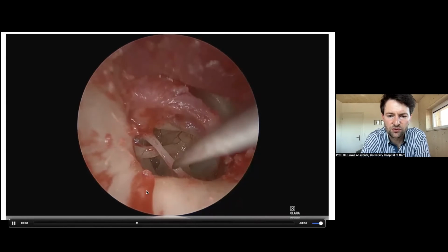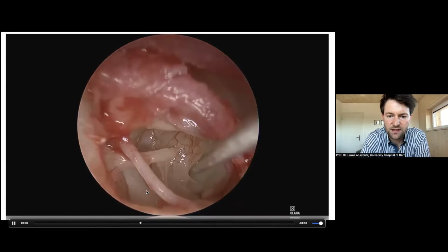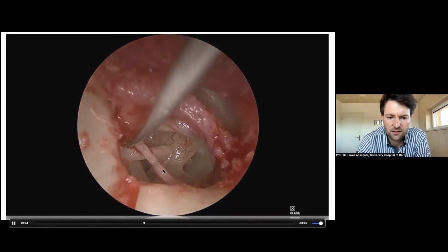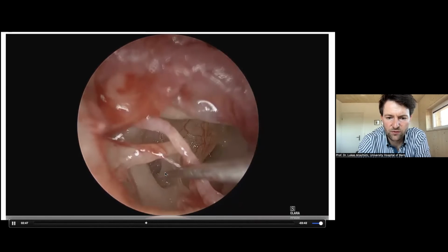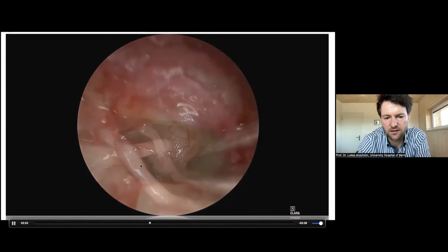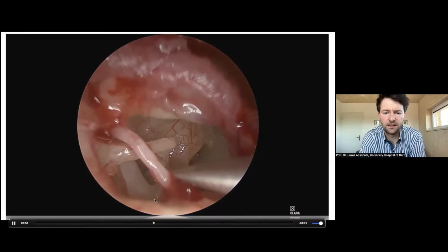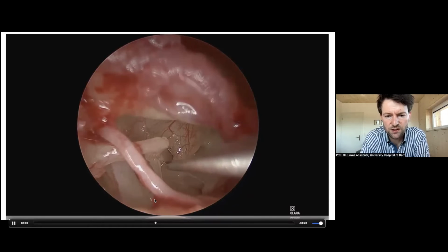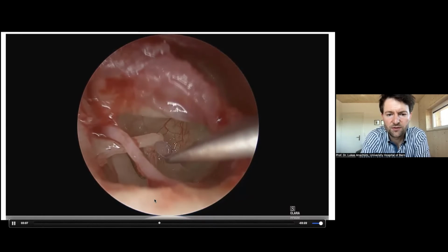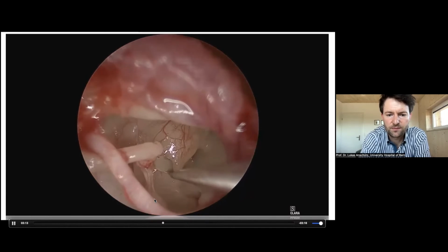Hammer is good, incus is good, and if we check on the stapes, you can see I see it very good, but sometimes it's difficult to reach it. You can see I need to move away a little bit the chorda, and you see the stapes is completely fixed. This is the facial nerve, and now I can cut open again the incudostapedial joint. I like to do it with a sickle knife, with a round knife, but you can also do it with a hook or whatever instrument you are used to. And we can see now good position, a good movement.